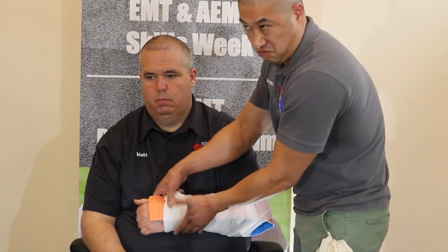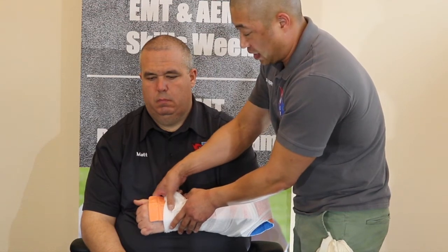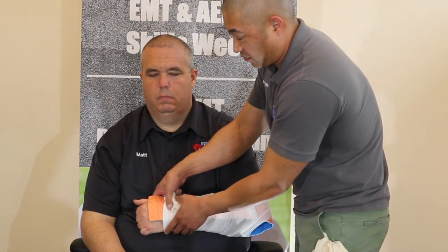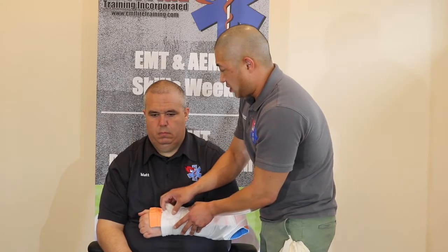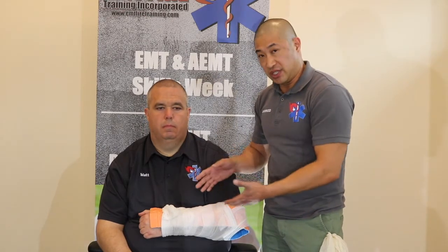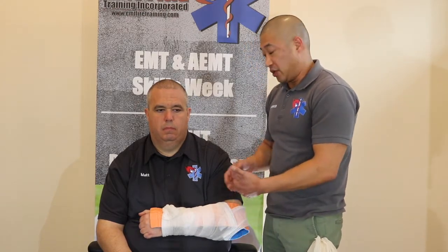Push on the nail bed of one of his fingers and see if it pinks up — from white to pink in less than two to three seconds. Go ahead — can you wiggle your fingers still? Any numbness or tingling? You can feel me touching your fingers? That's how we determine that what we just did didn't make the situation worse and the patient hasn't had an acute change. Once splinted, this can be a little uncomfortable, so placing the patient into a sling to provide more stability and comfort is totally acceptable.